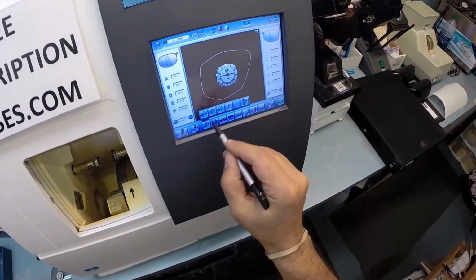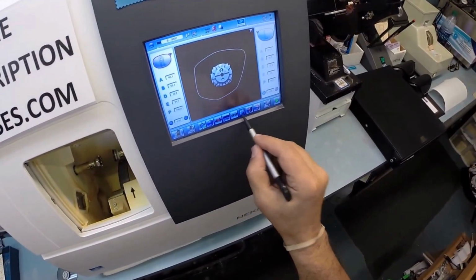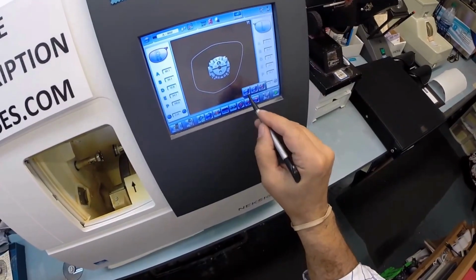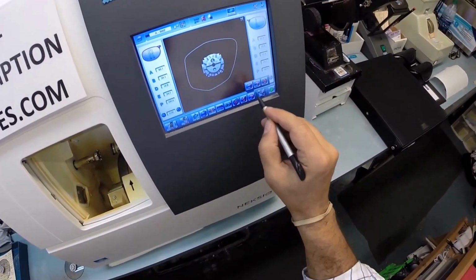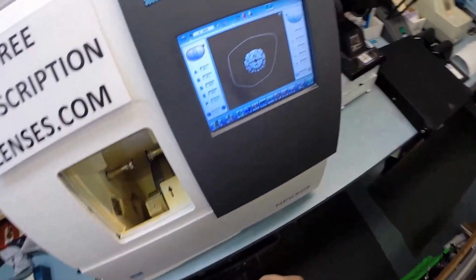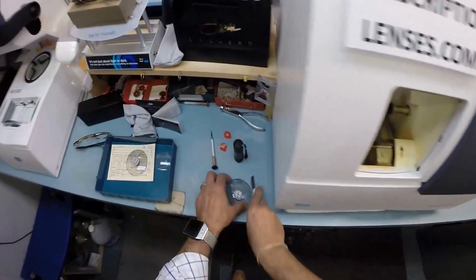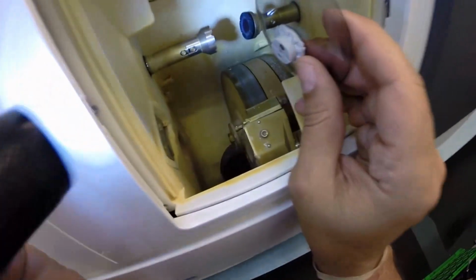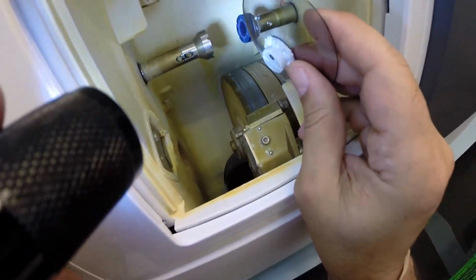These are polycarbonate lenses. I do not want to polish the edge of your lens because it's not going to be seen anyway. I'm not going to put a bevel on the front surface of the lens. I'm only going to put a bevel on the rear concave surface of the lens. And that concludes your vocabulary lesson of the day. So let's go ahead and put your lens into the chuck, or as I like to call it, the Charles, because I don't know this machine well enough to call it Chuck.